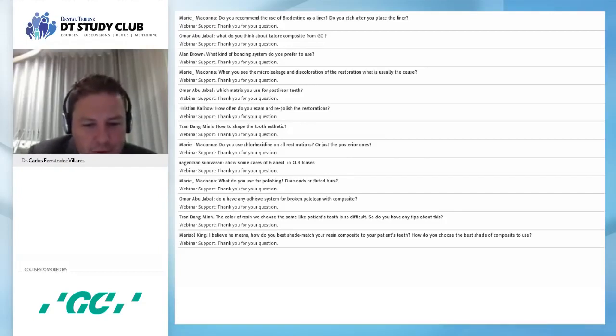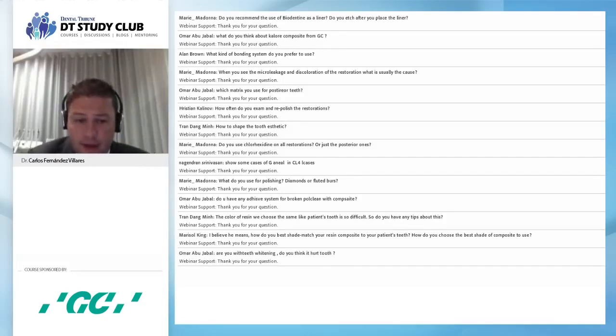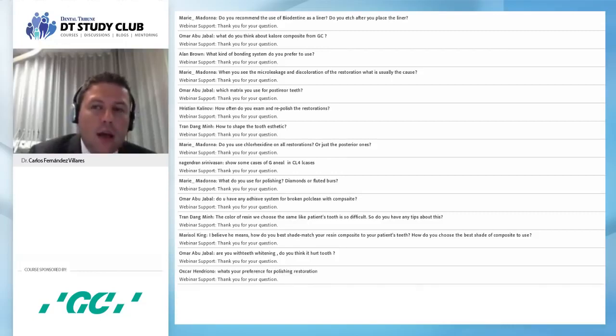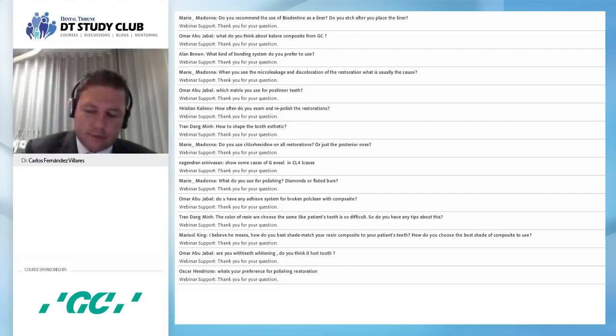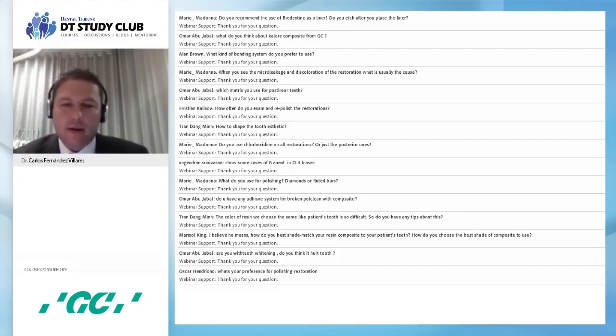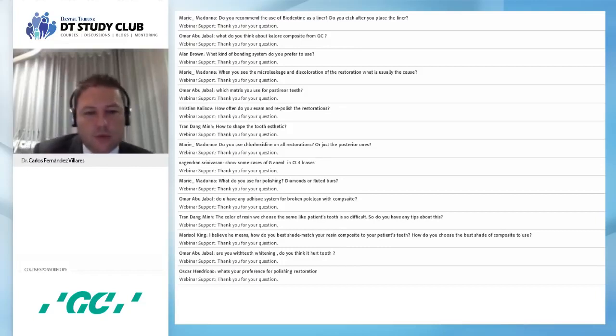Oscar Adriano, what's your preference for polishing restorations? Well, I said it before. I use the Soflex system for anterior teeth. Then I use diamond burs from Komet and flathead burs or tungsten carbide burs. I do it with a 1.5 handpiece, and then I use some flexible disc that allows me to make the shine with a special aluminum oxide paste. It's not a problem. But the most important thing is to go step by step. Know exactly your material. If you use a microfiller, it's going to be fewer steps. If you use a hybrid, you're going to have more steps. Know your material.